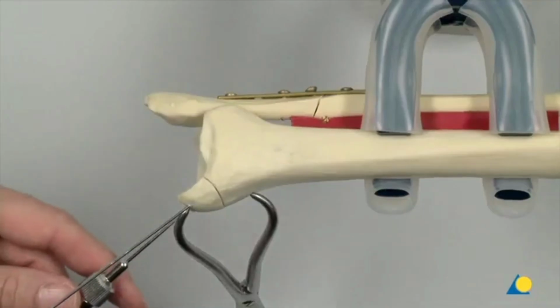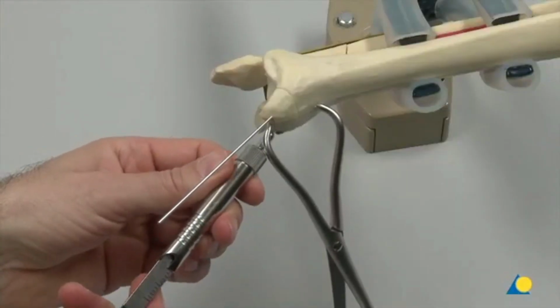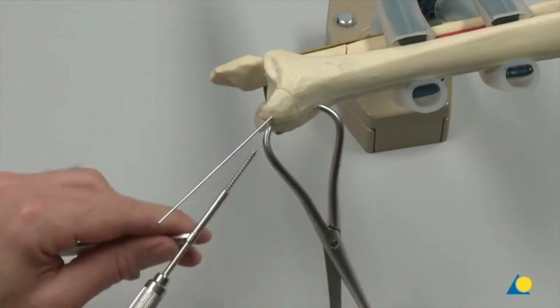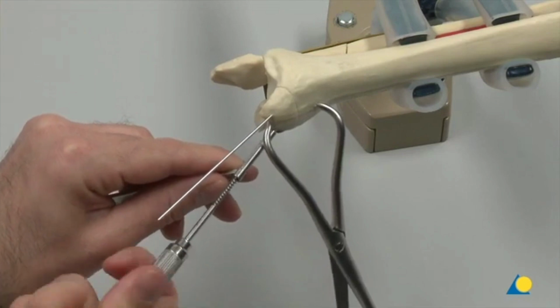The required length of the screw is measured with the depth gauge. The 4.0 mm cancellous tap with appropriate sleeve is used to create the threads.